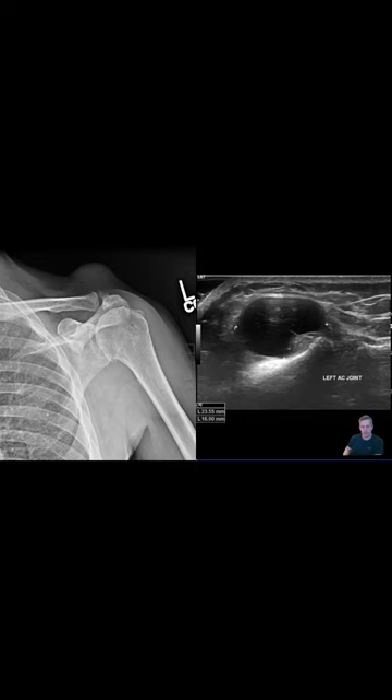X-ray and ultrasound are obtained. The X-ray shows both arthritis of the glenohumeral joint and AC joint. You see a high-riding humeral head, almost touching the acromion, and then above the AC joint you see this soft tissue swelling.